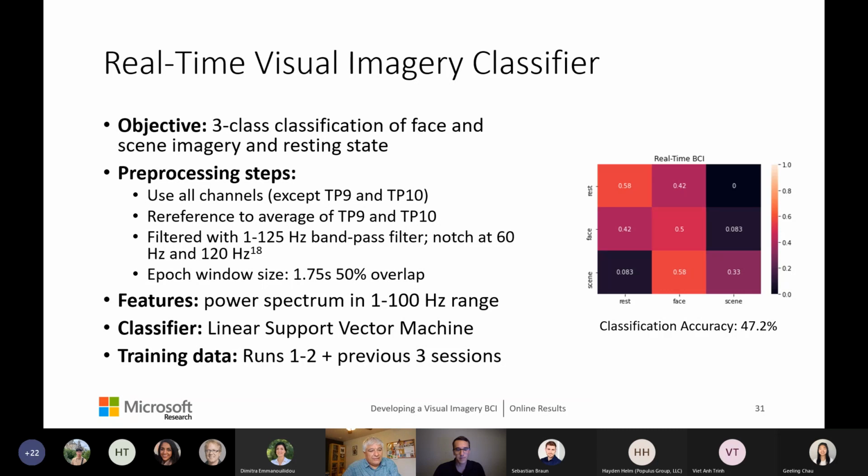It is actually not that easy. Simply put, not everybody has the skills to properly put on the EEG cap and make it work and get the data. We have done the opposite in the BCI team in Microsoft Research. We have the equipment installed in a lab and members of the BCI team go, one per day, take turns to put on the equipment and record the data.